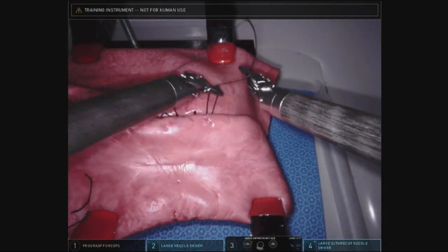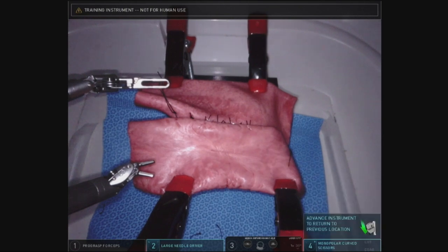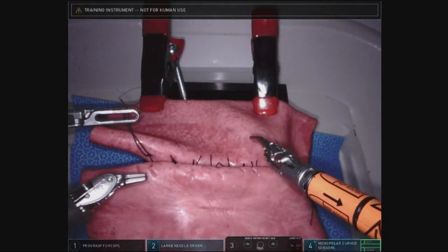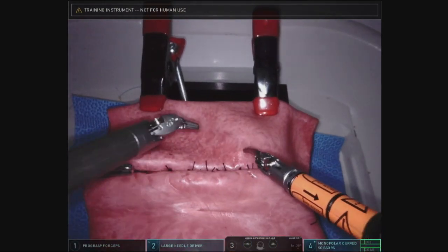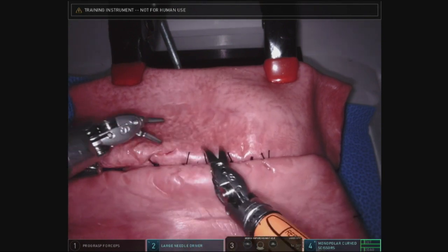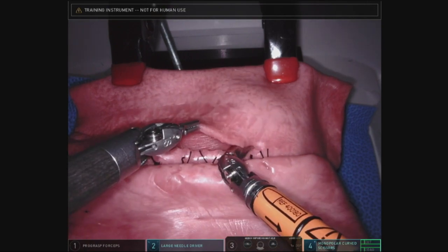This completes the posterior outer layer of silks. Next, switch the needle driver with the scissors and we're going to cut our enterotomies. Make sure you leave enough room between the suture line and your enterotomy for the inner layer.